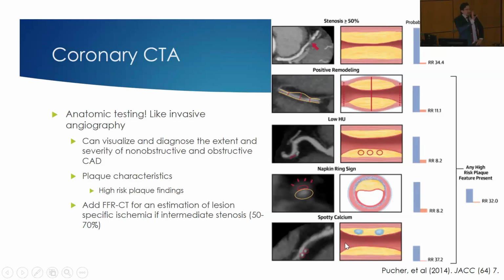Usually you see a dense calcification that accumulates over age along the walls of the artery. But when you have spots of calcium within the lipid plaque, that's another high risk finding. So when you read the report, if we see these things, we'll report on that. We'll say in parentheses, high risk plaque finding. We wouldn't expect you to know that on your own, but hopefully just keep an eye out for those things when you read the report.